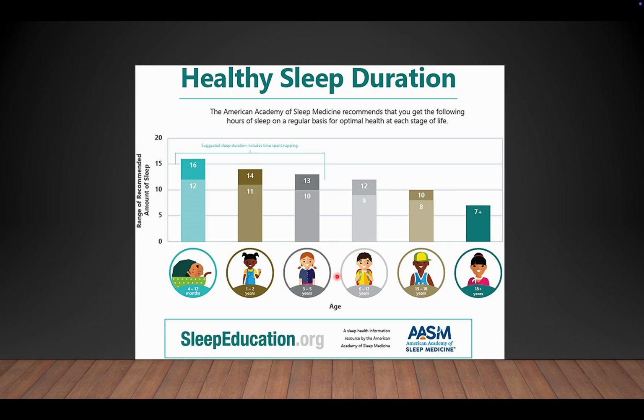The nap structure, with 5 nap opportunities and the overnight PSG, remains the same. The adult criteria of less than 8 minutes and SOREMs may not apply directly. Interpretation requires the developmental context of the child.